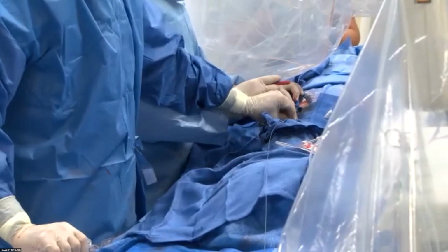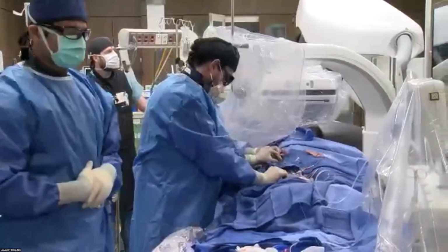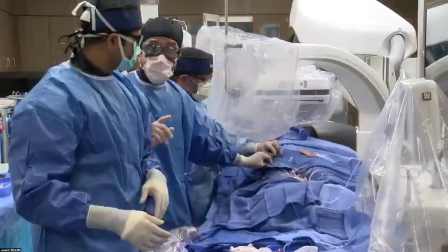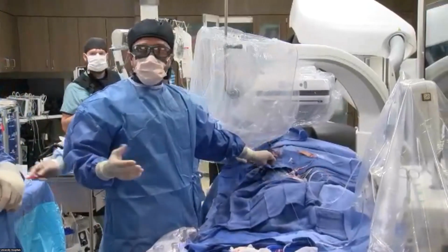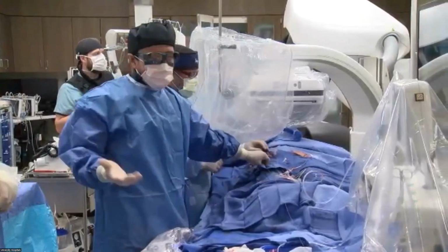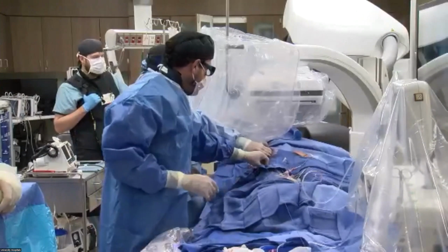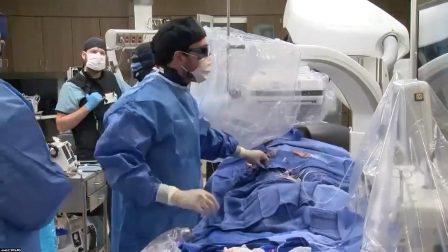Pre-dilatation was okay. As you could see, 3 seconds of pacing. This is a True Flow balloon. Some people do not pace the patient to use the True Flow because it has a hole in the center. We like to pace. We usually pace the same way. We don't do it without pacing. It's very safe, and her LV is normal. 3 seconds doesn't really impact anything.